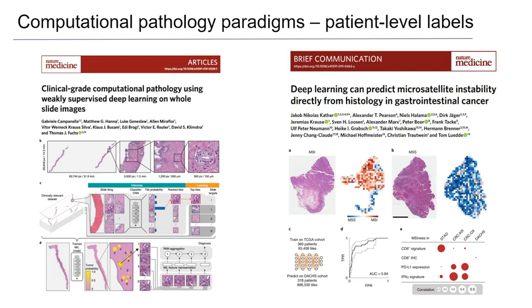So, the Paige prostate tool works like that. They were able to take the Memorial Sloan Kettering archive and not do any image annotation, and just use the existing diagnoses, which are in the medical record and structured, and just do a big machine learning problem with that without having to mark up any images. So that's very appealing. It has some limitations. In this approach, sometimes you can't really understand what the machine is thinking. You can maybe understand the areas of the image it's focusing on, but you don't really know precisely what it's measuring. So in some sense, it's kind of a black box.